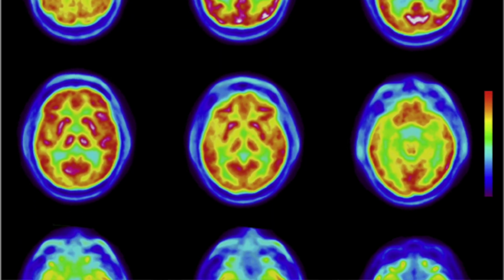Let's talk about when the doctor would request a PET scan. Usually, doctors request a PET scan when your vital functions need to be checked. This could include blood flow, oxygen use, blood sugar, or glucose metabolism, and it can also identify organs and tissue that aren't working like they should be.